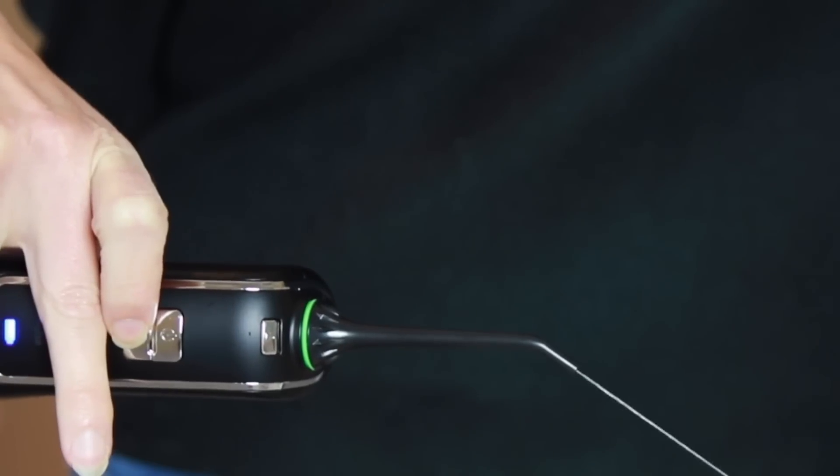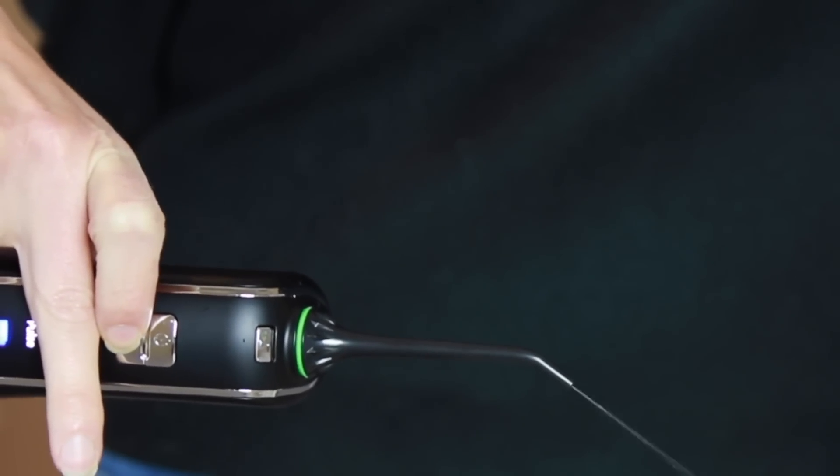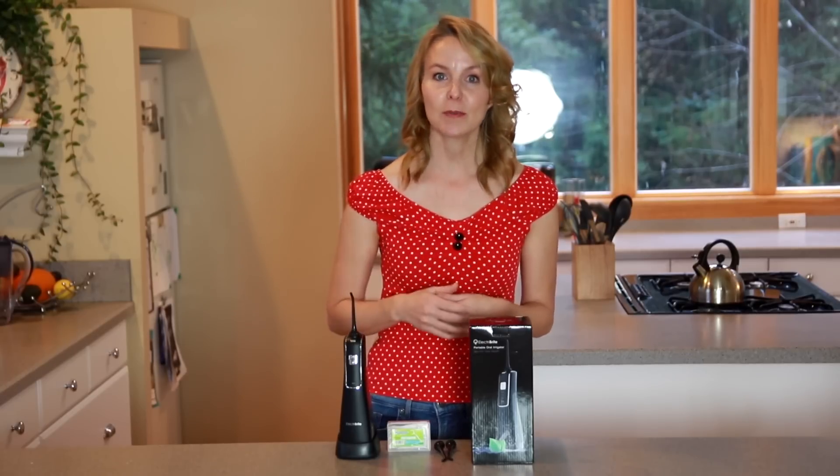It has three modes of operation: normal flossing, soft, and pulse mode. You can choose the mode that suits you according to your oral condition. Normal mode can be used for daily cleaning, and children can choose the relatively gentle soft mode. When residue accumulates in your teeth, pulse mode with a larger water pressure can be used.